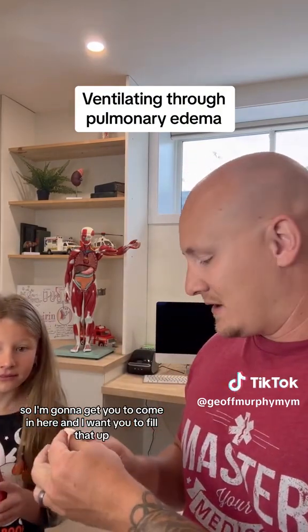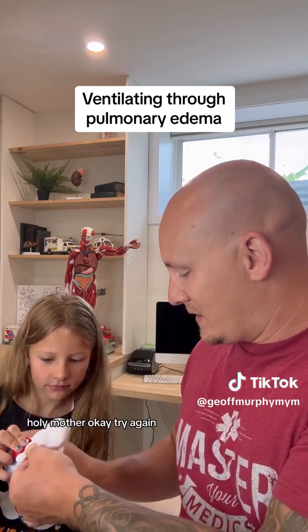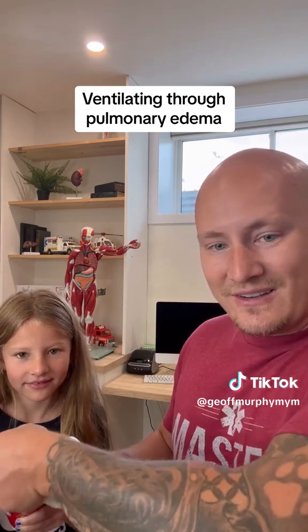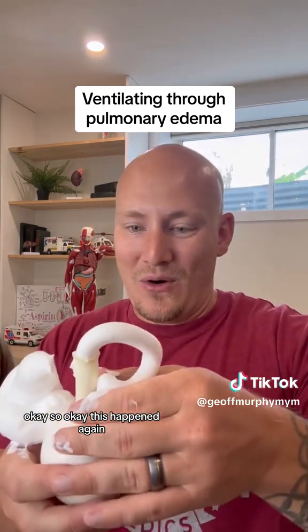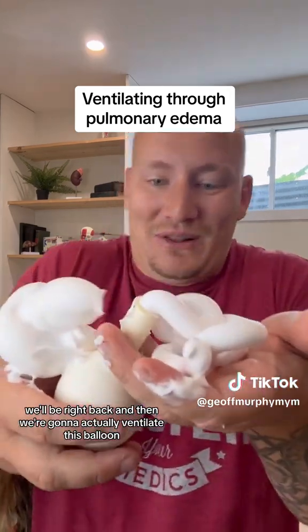We'll fill that up and seal it. After some difficulty getting it sealed, we'll be right back and then we're going to actually ventilate this balloon.